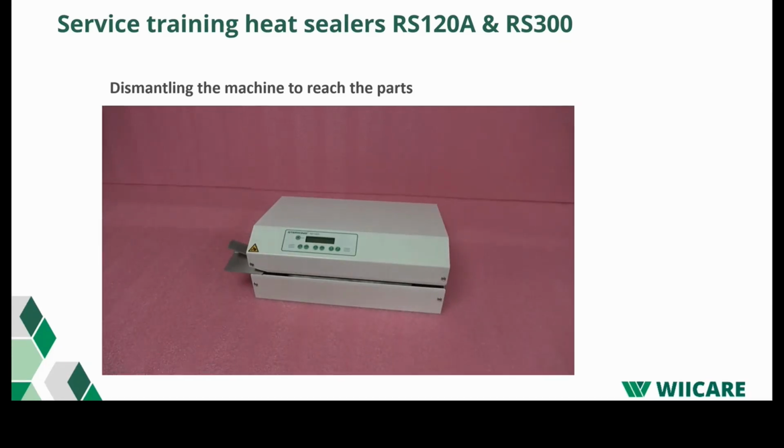In this video, I will show you how to replace the Teflon tape, transport belts and the pulleys. First we disassemble the hood.